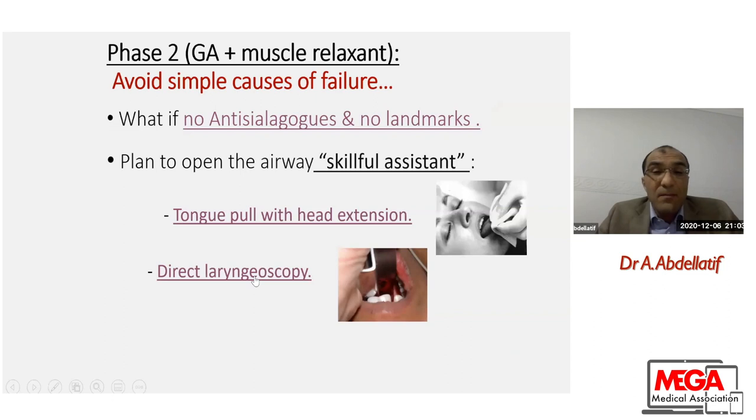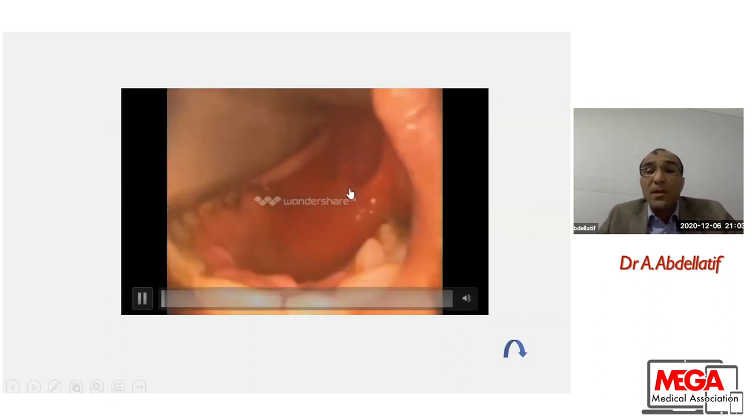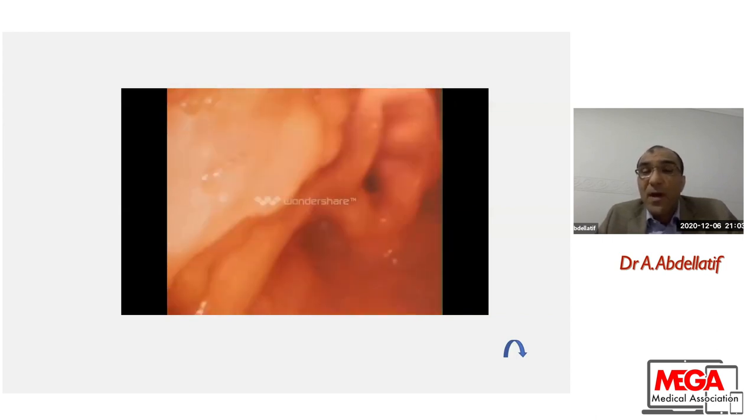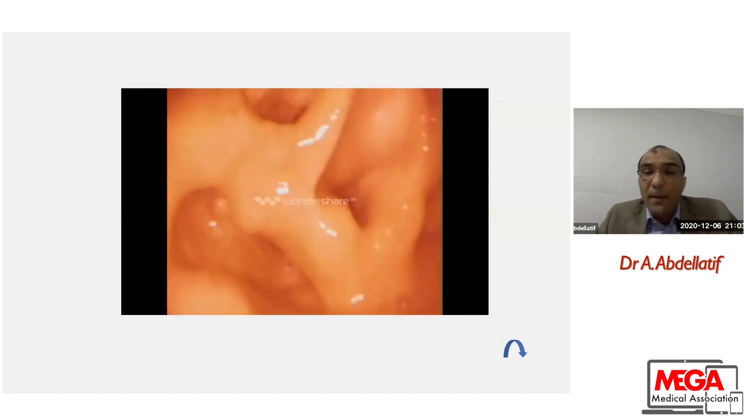Another easy method is to do direct laryngoscopy. The skillful assistant will do direct laryngoscopy for you, and he will move the tongue away, and you will see a lot of space to go.